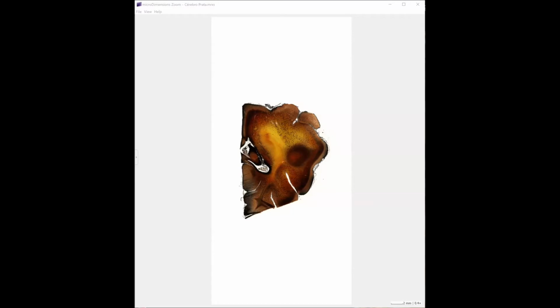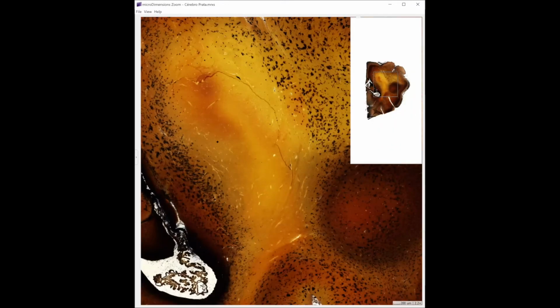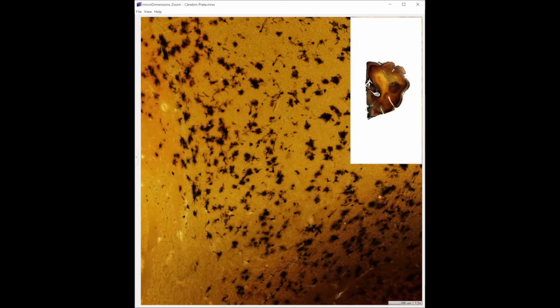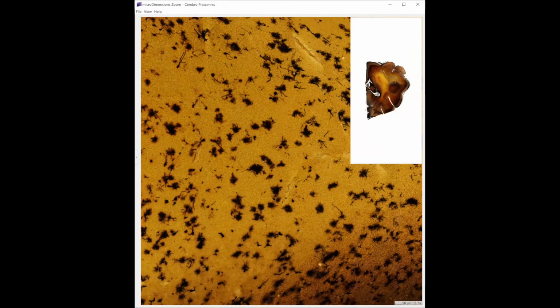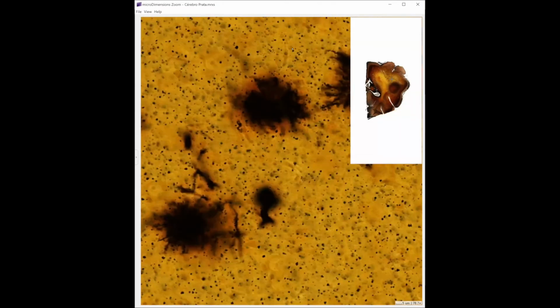And then we have this histological view of the problem. We can even compare the healthy part of the histological view with the unhealthy part. So you can see we are zooming in, and it keeps the quality, so you can really go very deep on what we can see.